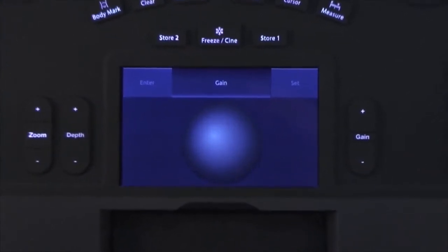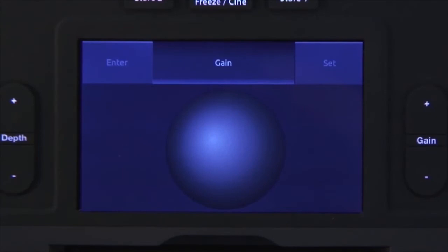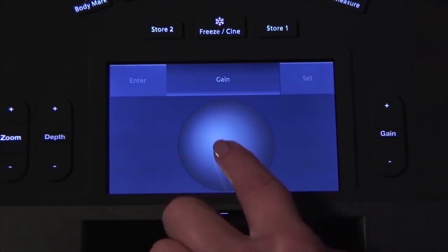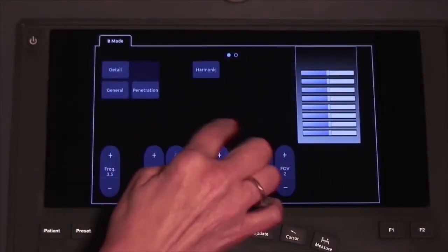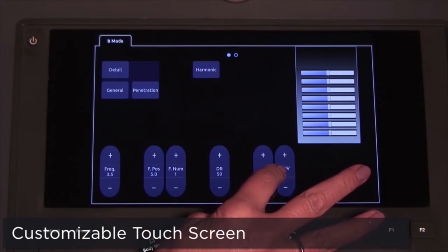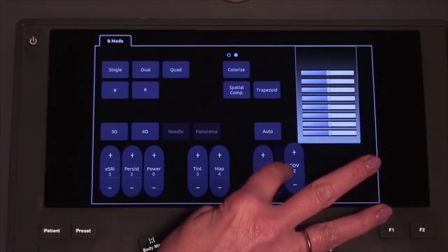The 5-inch touchscreen is a multi-function virtual trackball. Not only does it act as your trackball, but you can swipe across the top to quickly change gain. The multi-touch functionality allows you to zoom the image or resize the color ROI when in color mode.